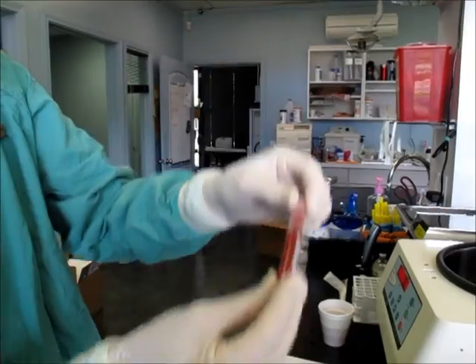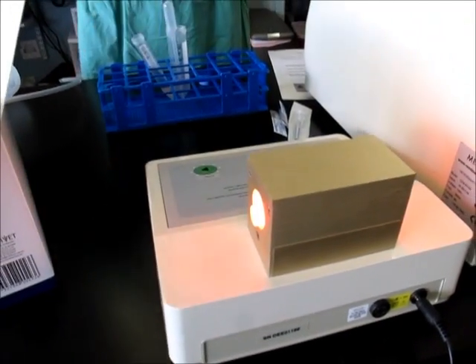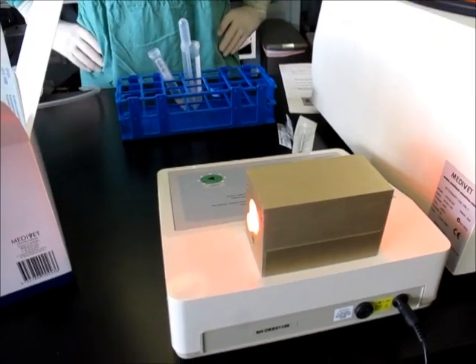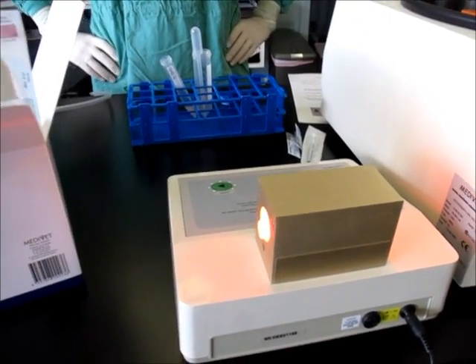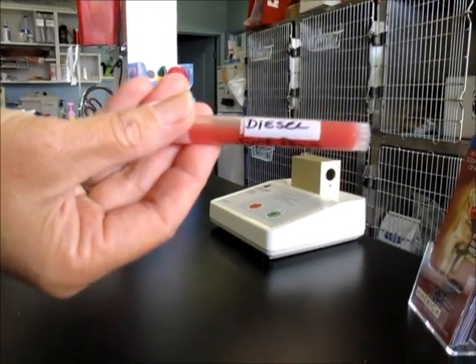The last step is we put it in a light activation unit for 20 minutes. These specific wavelengths of light are known to help activate the stem cells. This is the final product.